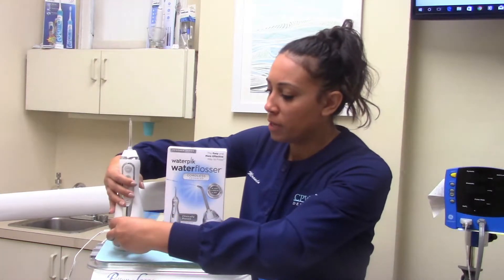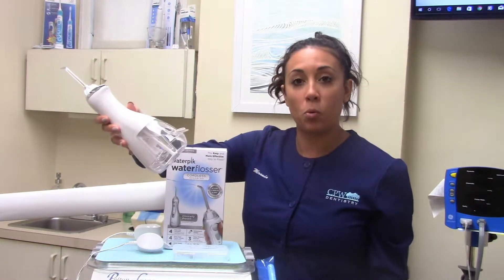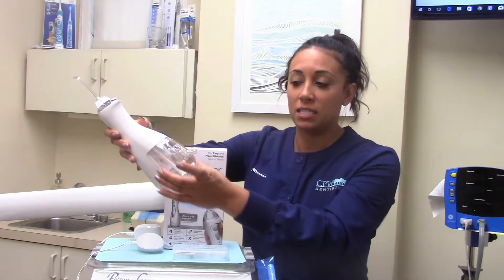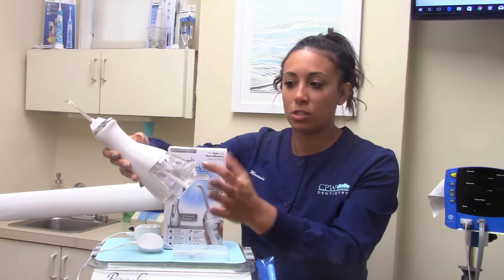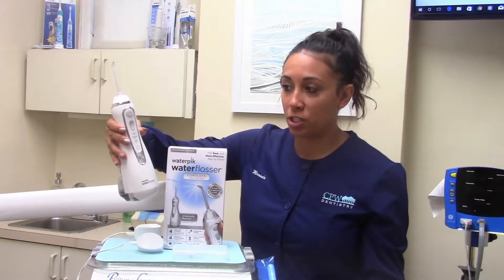The second thing you want to do is go ahead and fill the base up. You'll see it here — it's just got a little port that you open up. It doesn't detach. Just fill it up with regular tap water and close it, and you're pretty much good to go.